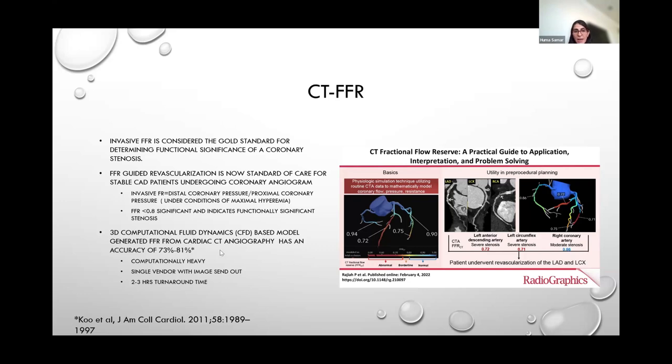It has very good accuracy, but it's very computationally heavy. It is not something that can be done on site in any given imaging center. The CT images have to be sent out to a vendor, and then this quantification is done, these FFR values are generated, and then these images are sent back, and this takes about a couple of hours.